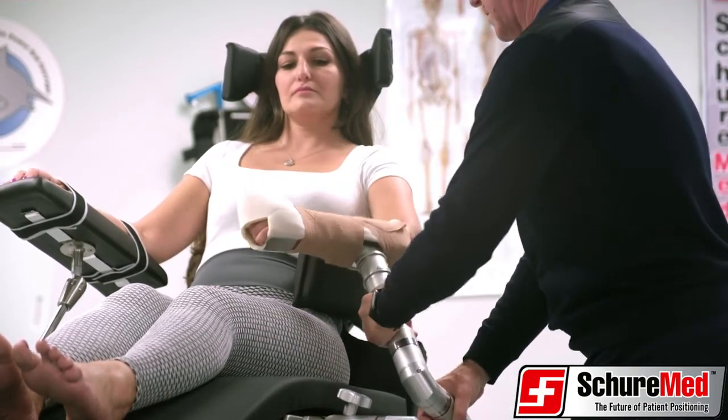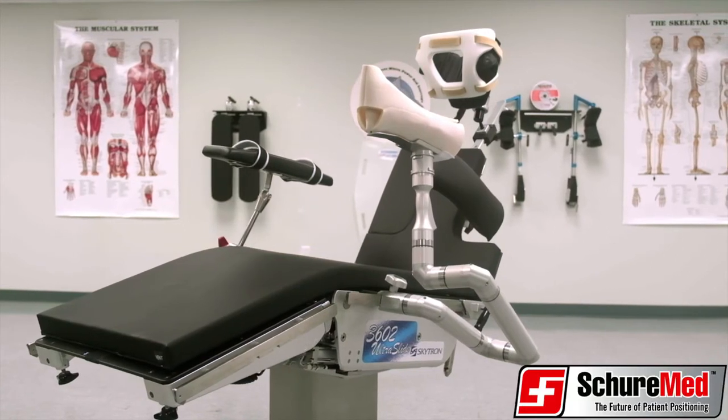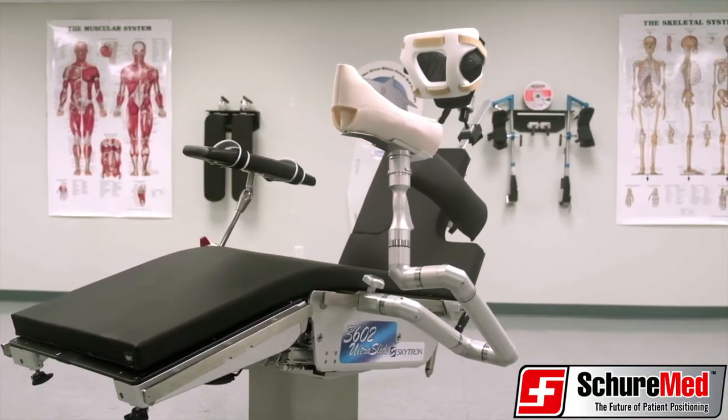The SureLock XPS has a 500 pound patient weight capacity and comes standard with a 2 year manufacturer's warranty.